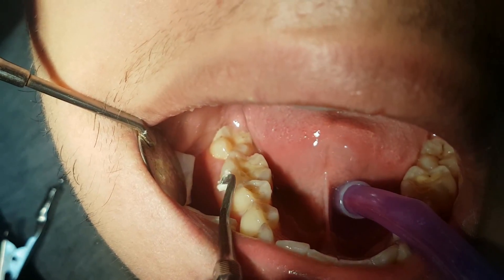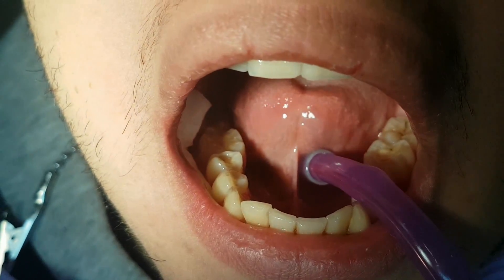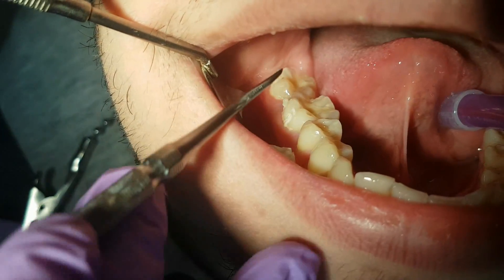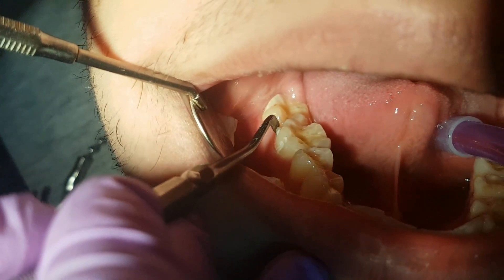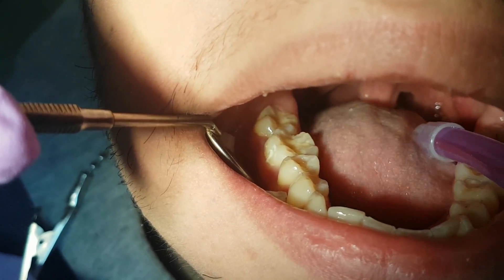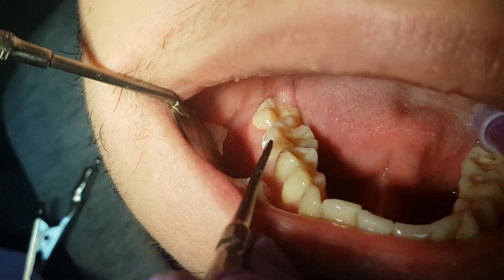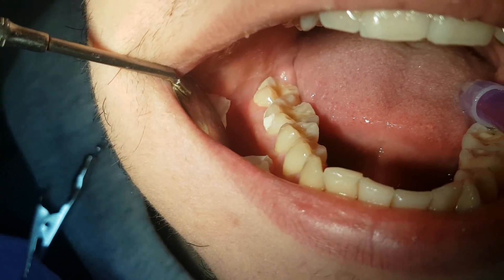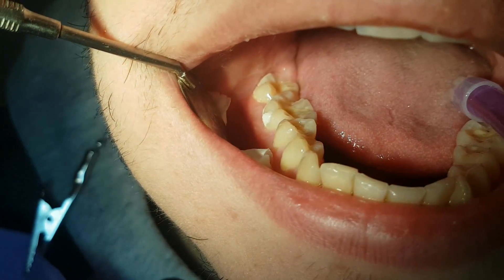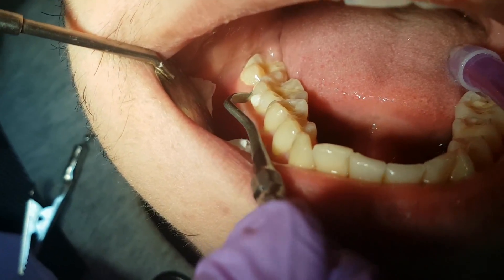Now, using a plastic instrument, we apply the filling separately on both prepared cavities. We have to adjust the filling so it matches the dental structure, working carefully with the plastic instrument.